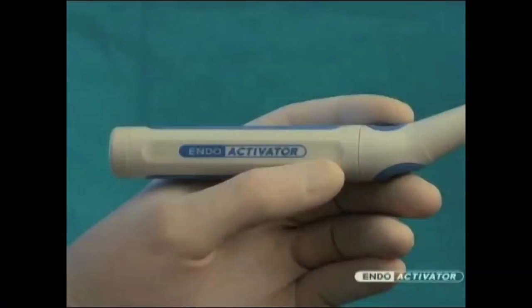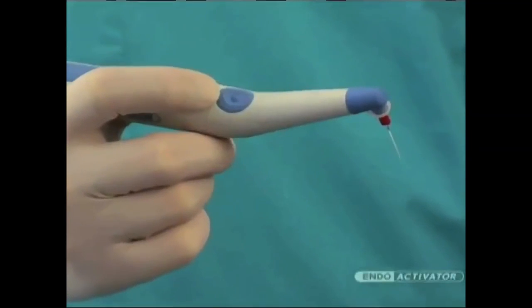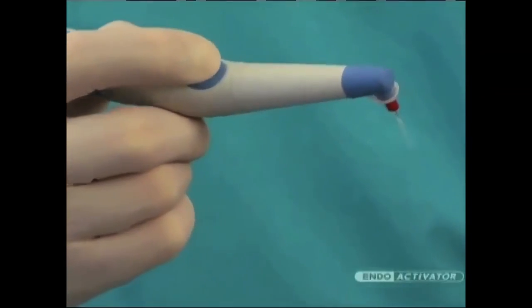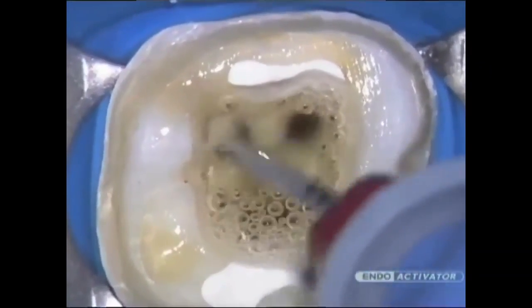to use technology like the EndoActivator to remove the smear layer before we obturate the canal, and we can use solutions such as Q-Mix in conjunction with the EndoActivator.